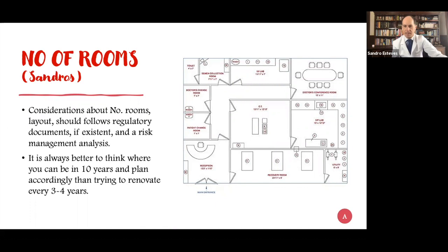But in many circumstances, if the workload is not so heavy, we like to have some transfers performed in the operating room in the afternoon. We do the oocyte pickups in the morning, so we have the availability to also distribute the embryo transfers in the operating theater. So over here, according to our regulations, it's allowed to use the operating theater for embryo transfers.